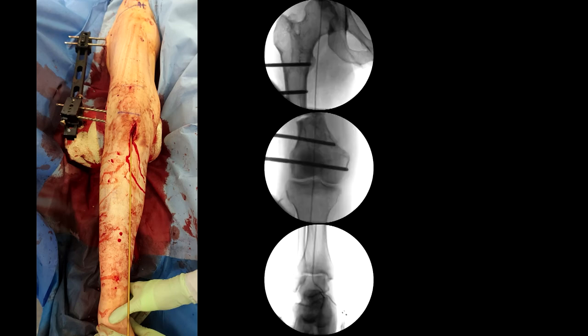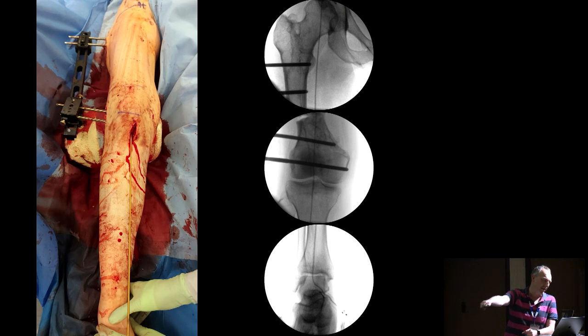So here you can see we've used a diathermy cable, placed it on the hip, placed it at the center of the ankle, checking it's passing roughly through the center of the knee, where we would wish our correction to be. We've applied a little bit of translation on those pins as we've planned. Looks to be acceptable to our preoperative plan.